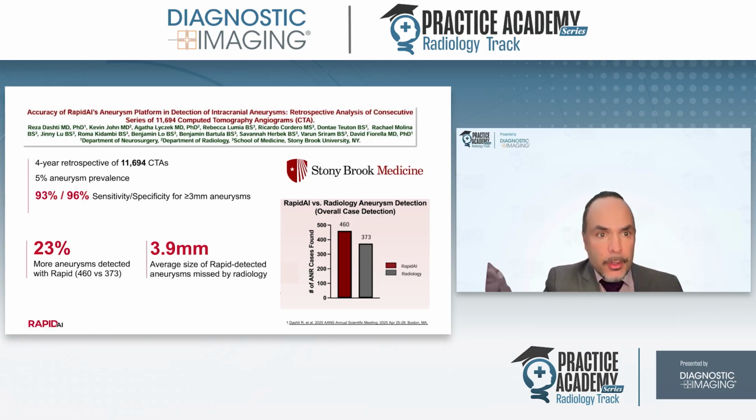And they found across a very large retrospective cohort a much higher prevalence of aneurysms in unsuspecting cohorts and standard adult populations, reaching 5%, which was significantly more than the historic axiomatic 3% prevalence in past human studies, really pointing to how much more sensitivity is enabled if you have assistive devices with high sensitivity and specificity.